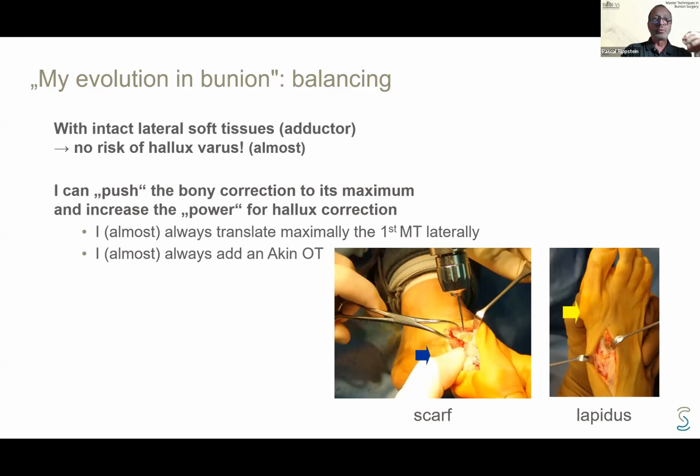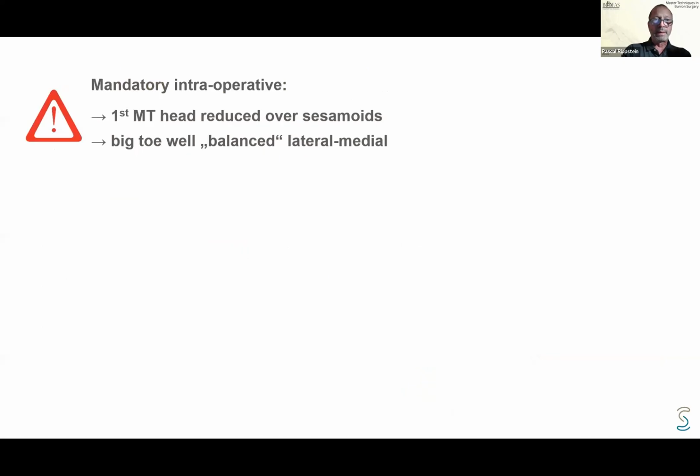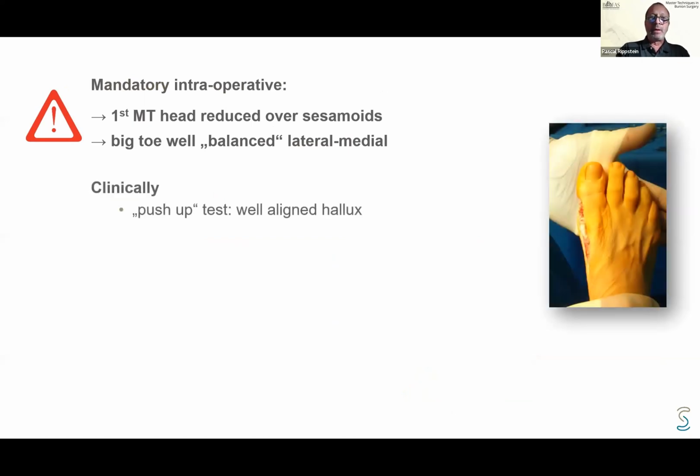And pushing the correction to its maximum had increased the power for my hallux correction. And nowadays, I would say I almost always translate maximally the first metatarsal laterally, and I additionally add an akin osteotomy, but that's another story. Now, what you have to realize, and that's probably the most important thing, it's absolutely mandatory during the surgery that your metatarsal head is reduced over the sesamoid. Your big toe should be well balanced on the lateral and medial side. And what you want to see during the surgery is that when you make the push-up test, which is a simulated weight-bearing situation, you want to have your big toe aligned without any forces pulling in varus or valgus.